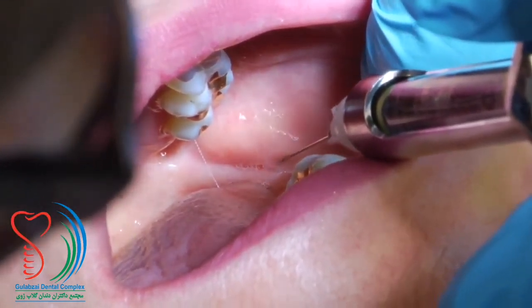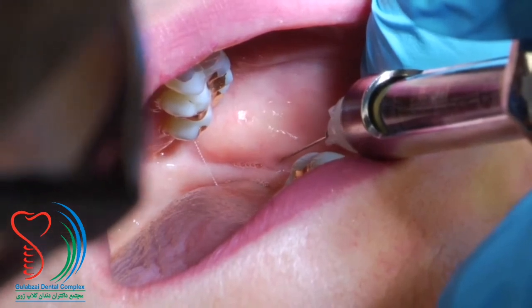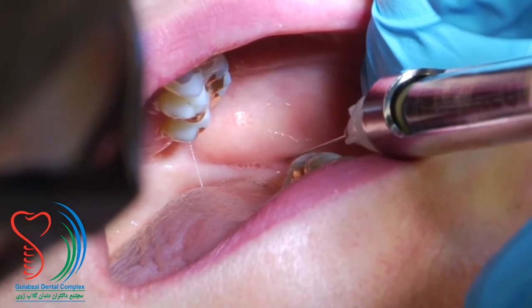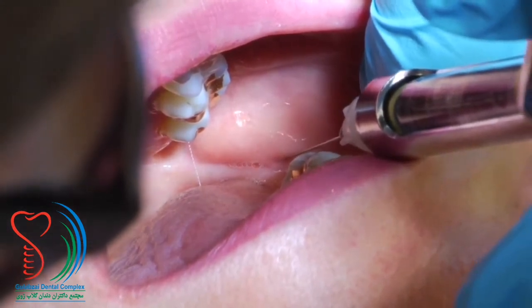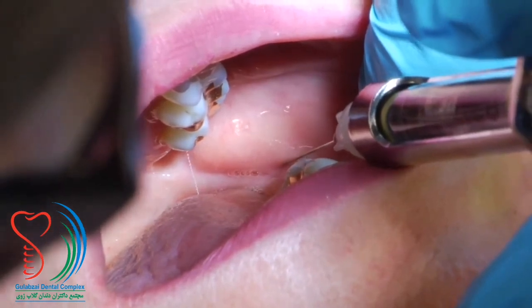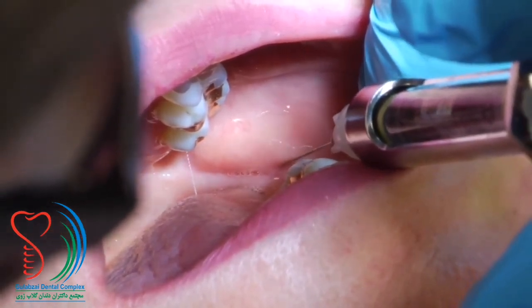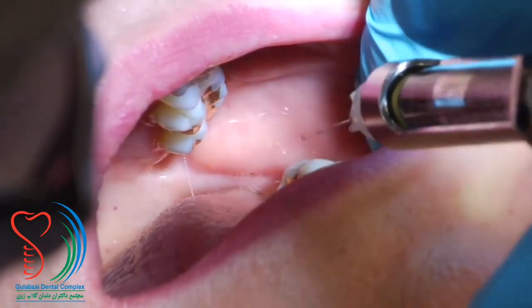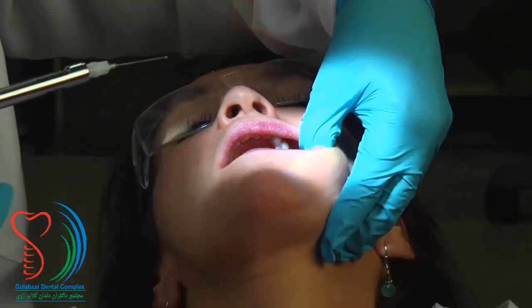This is a very shallow injection, and you'll meet resistance quickly. After a negative aspiration, another 1/8 of a cartridge of anesthetic is deposited here, and that should complete the full carpule that you started with. So you have used the entire cartridge to give these 3 block injections for the mandibular quadrant.